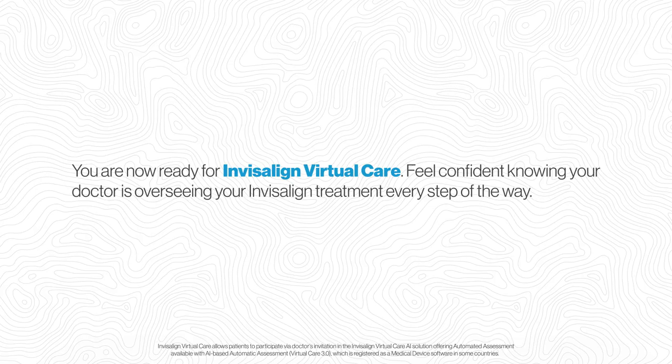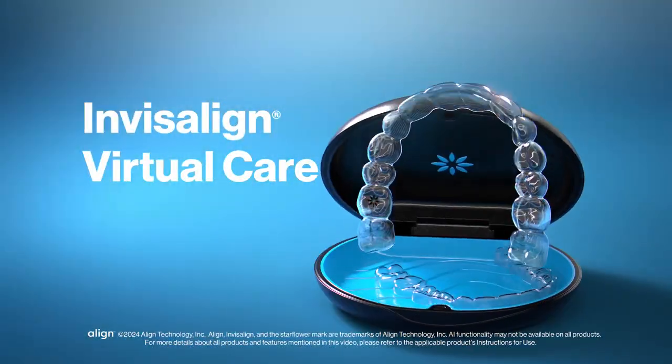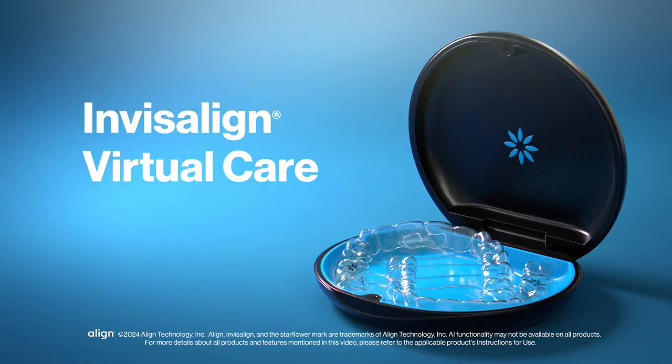You are now ready for Invisalign Virtual Care. Feel confident knowing your doctor is overseeing your Invisalign treatment every step of the way. Congratulations on taking another step on your journey to a new smile.